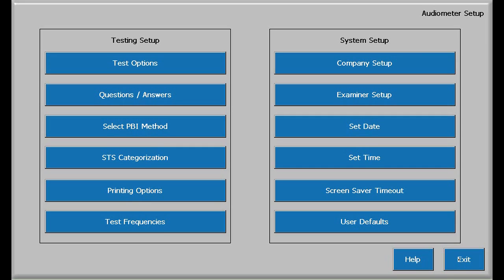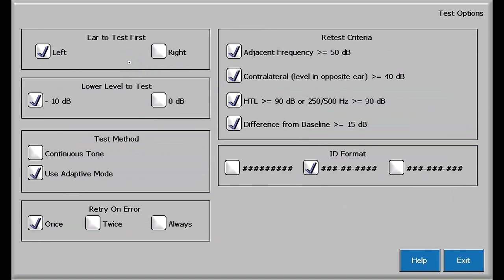If you entered the configuration password correctly, the audiometer setup will be displayed and we can start configuration by touching Test Options.